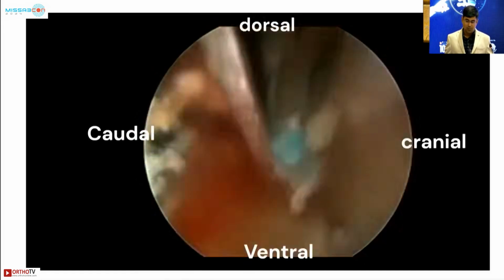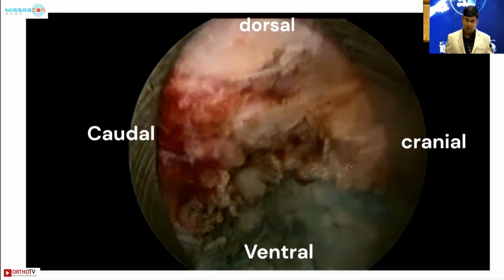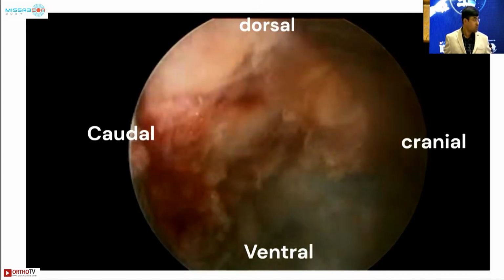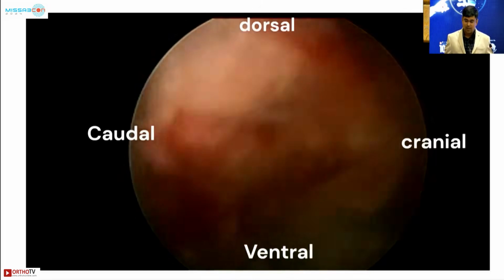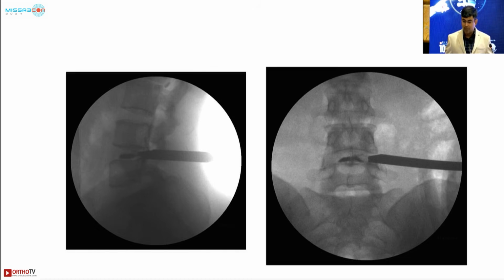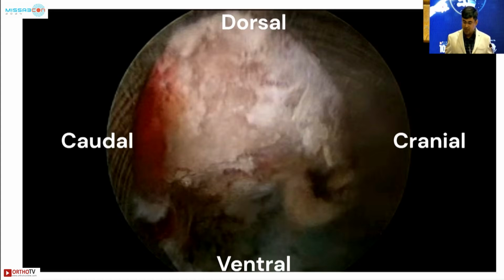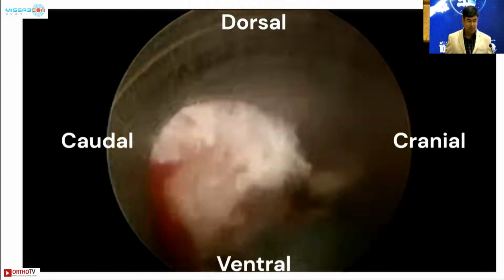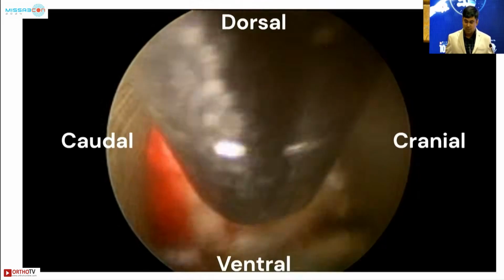This was because of this hypertrophic part of the superior articular process, which was not allowing the instrument to go in actually. And as I was trying, I was going more anterior into the disc space rather than going horizontally into the epidural space. So I came out a little bit and started doing the foraminotomy. I always keep the trephine and the Kerrison punch in my transforaminal set. So this is how I do it.